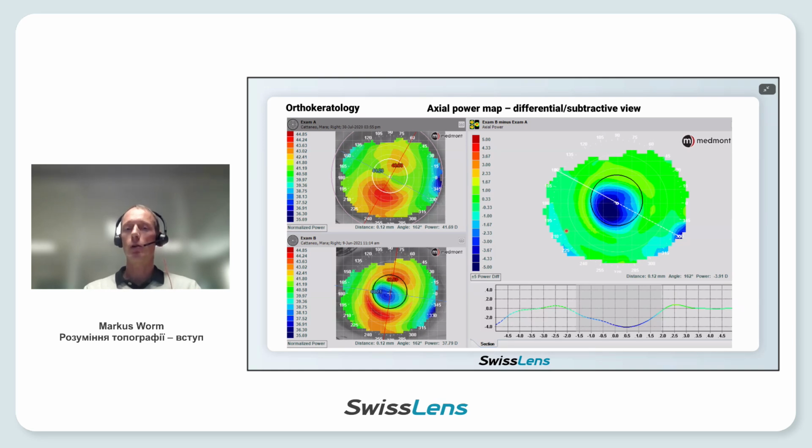And you can already see how much power we have modulated. It's shown here because it's the difference between these two topographies. It's minus 3.9 diopters, so the myopia is reduced by 3.9 diopters. You can also see the flat blue treatment zone here and its position compared to the pupil, the black ring.